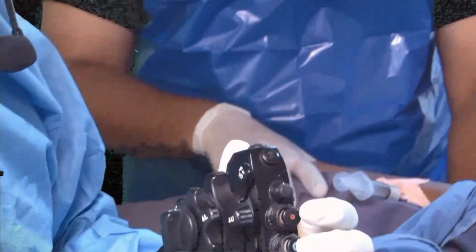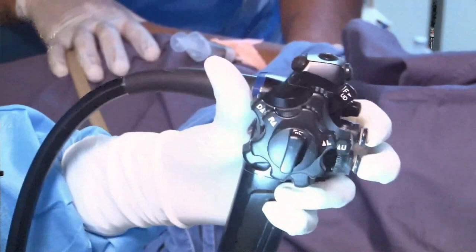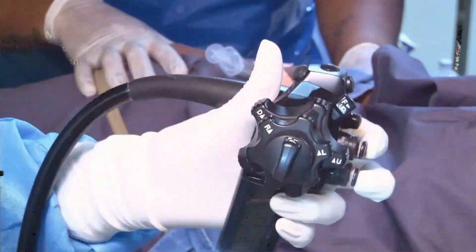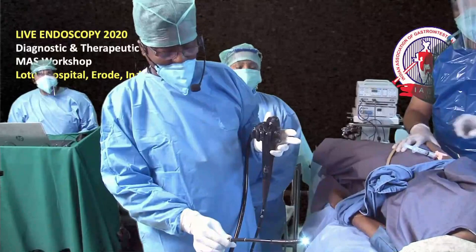I hold the control head with my non-dominant hand, engage two fingers to the buttons, and allocate my thumb to control the big wheel. For the beginner, the most important control is the big wheel toward you — most movements can be accomplished with this single motion. If you over-angulate, move it away to correct. The second key technique is soft clockwise rotation of the shaft.